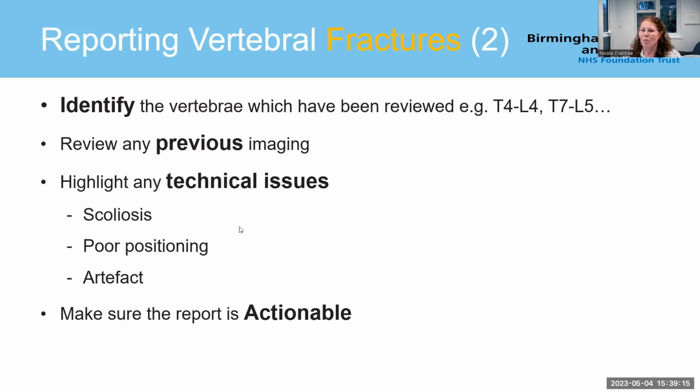Highlight any technical problems that you might see, whether there's any scoliosis, any due to poor positioning, either because of the patient or because of the operator, any artifacts that might be there in the imaging. And most importantly, make sure the report is actionable. So what you say in the report can be actioned on, whether that's normal and nothing needs to happen, or whether there's a vertebral fracture and something needs to happen.